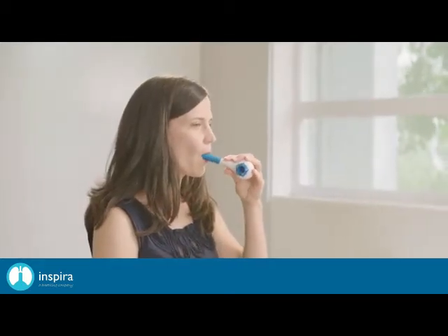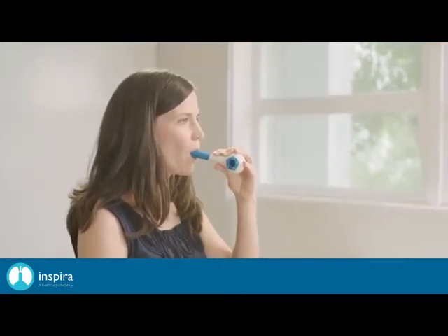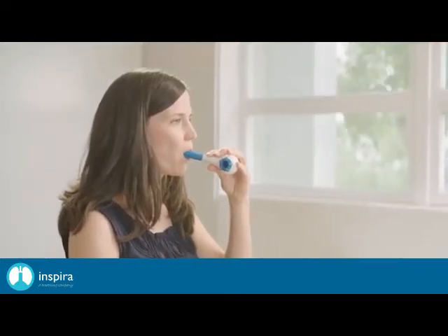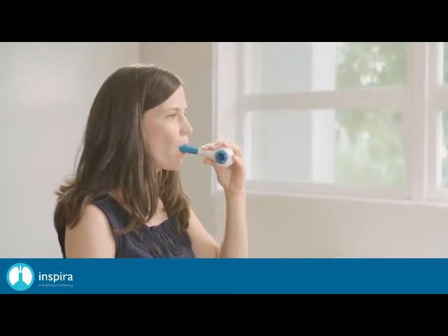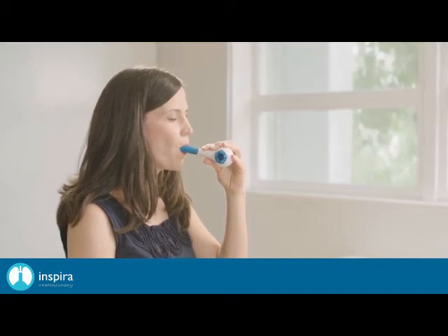We're going to do 5 breaths in a row. 1, 2, good job. 3, 4, and your last one. Great. Okay, how do you feel? Good. Okay, do you feel out of breath?